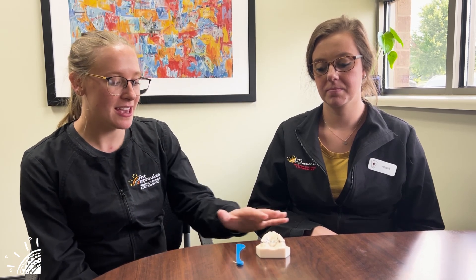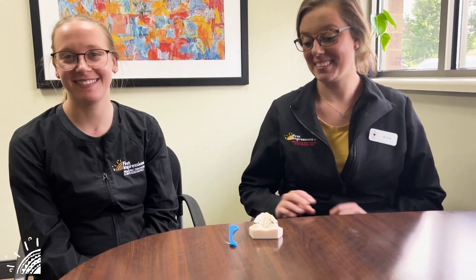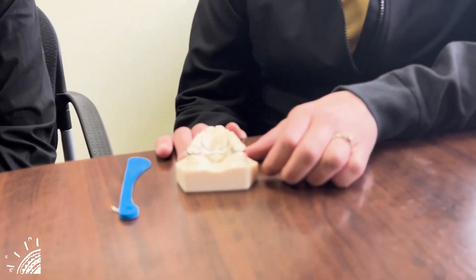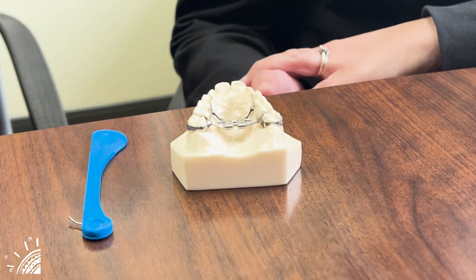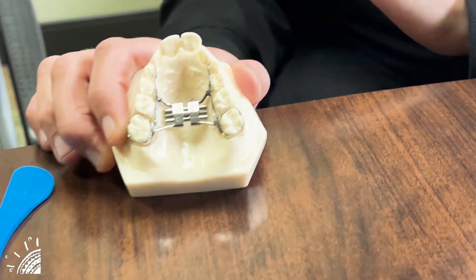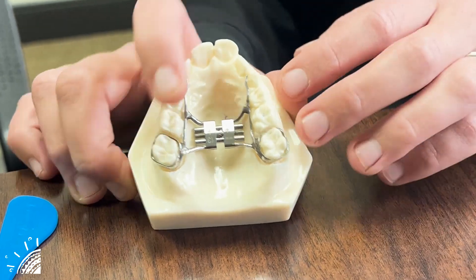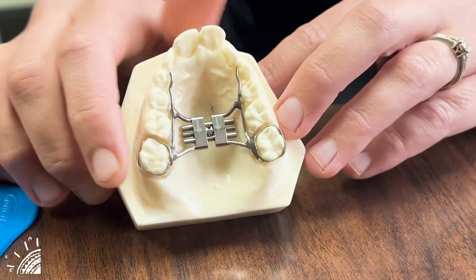So we have this key and the model of the expander. It's easiest if you have your child lay down on the couch or on a bed when you're ready to turn the expander. Also having a light present, because it is a little bit dark in there and being able to see the holes — the light will help out.